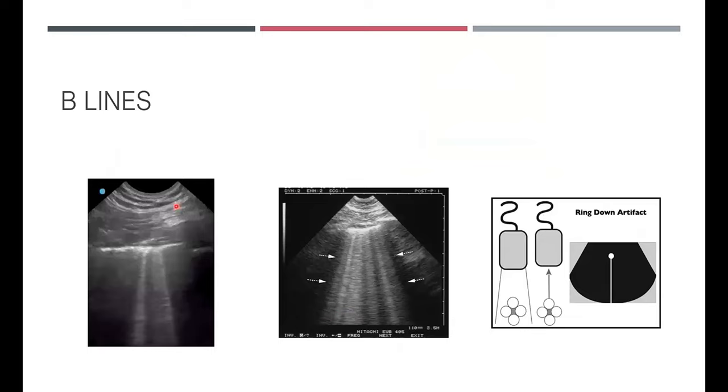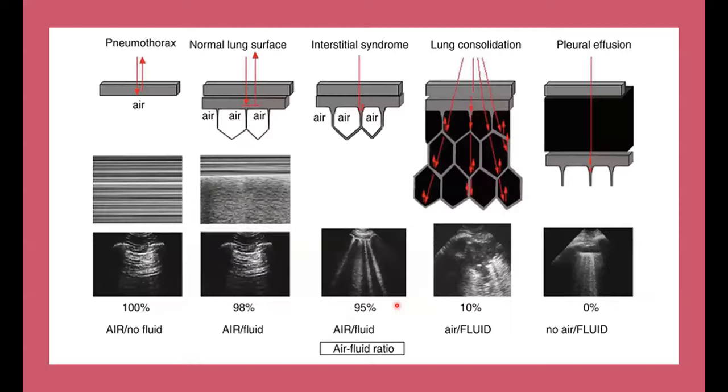Now, this is the pleural line, this is tissue. And what you can clearly see is these B lines, which have kind of merged together. If the B lines merge together to form one complete portion, then these B lines are becoming more compact and we call them compact B lines. But clearly what you can see here is the classical progression where the interstitial fluid is going up to the point where these B lines are starting to merge. And this is basically interstitial edema for you.